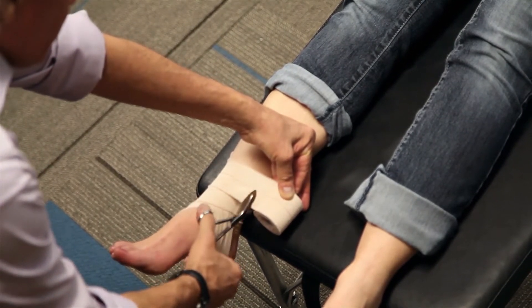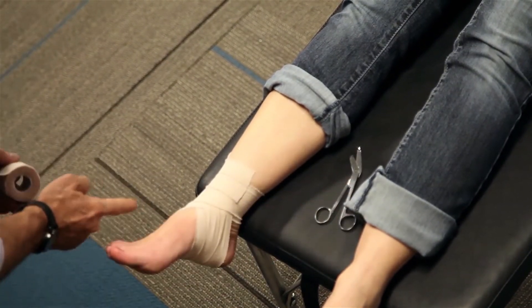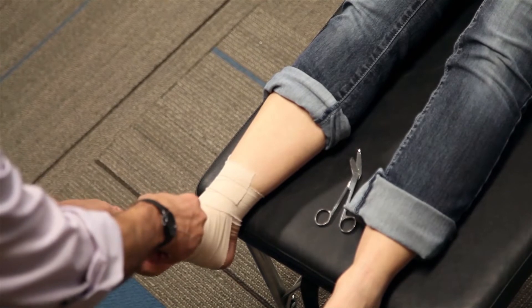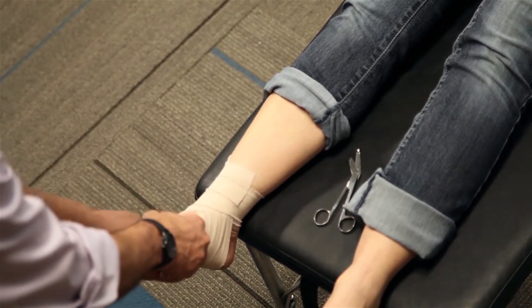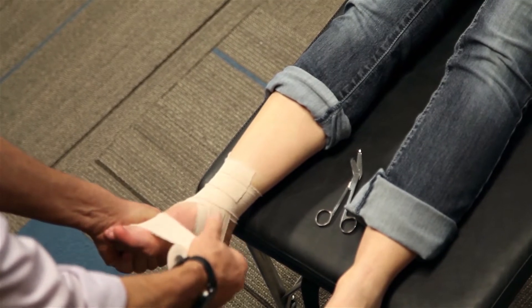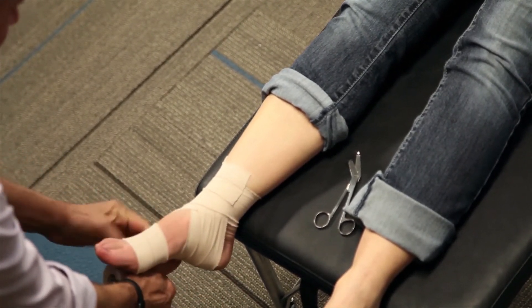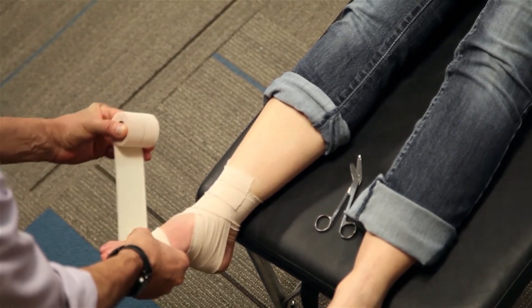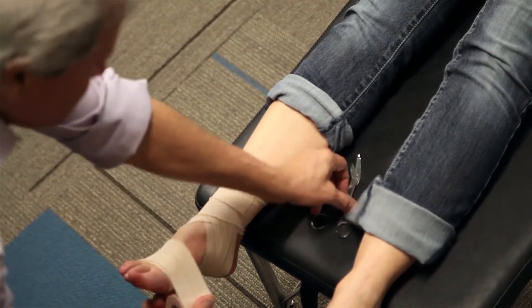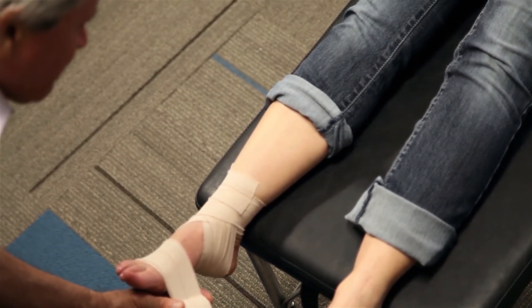Now the second piece of tape — you want to make sure that you do not tape it too tightly as it will jam the metatarsal heads together. So it's light tension. You're going to anchor it on the dorsum of the foot. Again, hold it with your thenar. Take all of the elastic stretch out of the tape and go around the foot one and a half times. Then take the banded scissors and clip the tape.